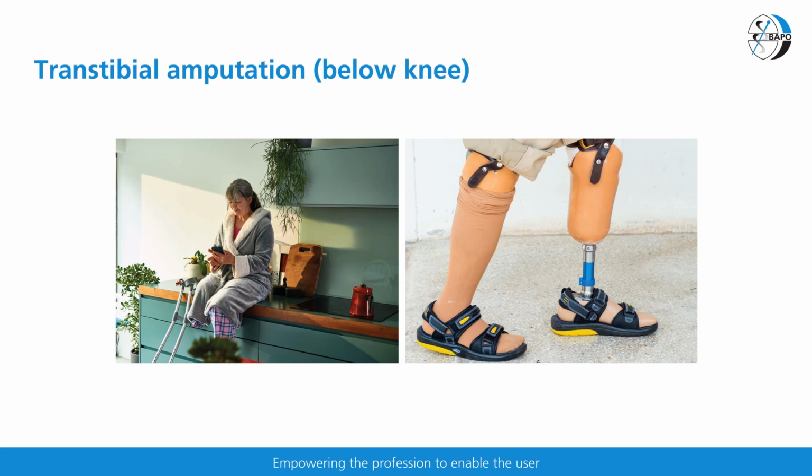ambulation goals. Transtibial amputations have a wider variety of sockets and suspension options, as well as a wide variety of componentry. In the UK, prosthetic options will be discussed with the amputee and a decision determined by the amputee's realistic goals, expectations, and requirements for day-to-day functioning, including work and leisure-based activities.